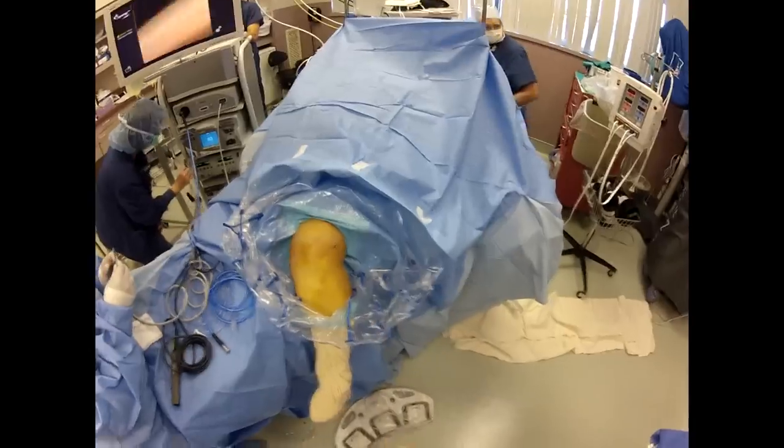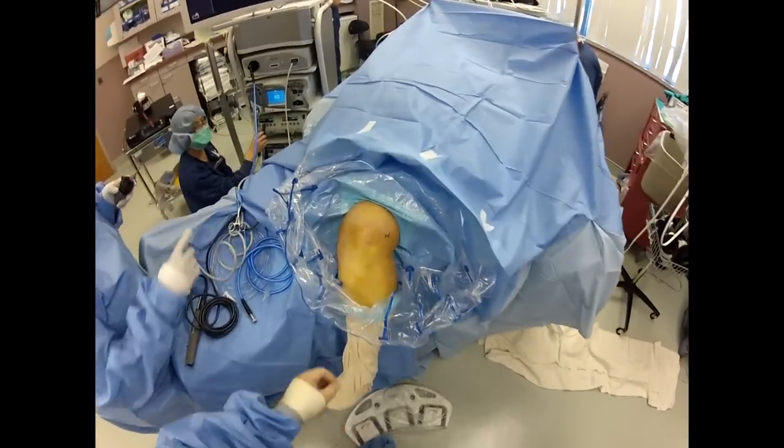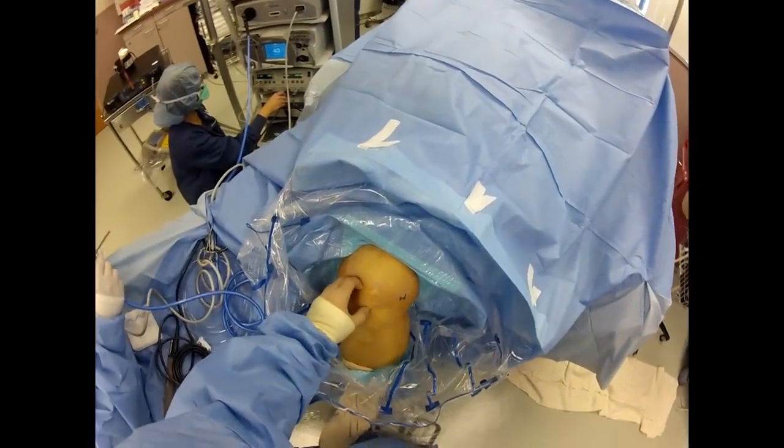This is Dr. Craig Zeman. We're getting ready to do a knee arthroscopy. It's just a routine knee arthroscopy. She has a meniscus tear on MRI.